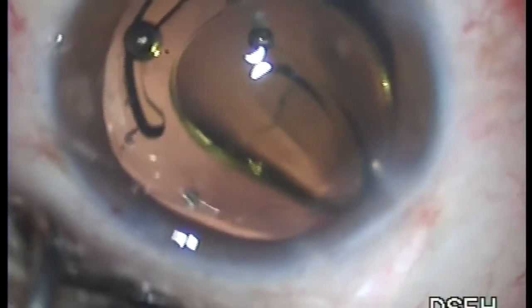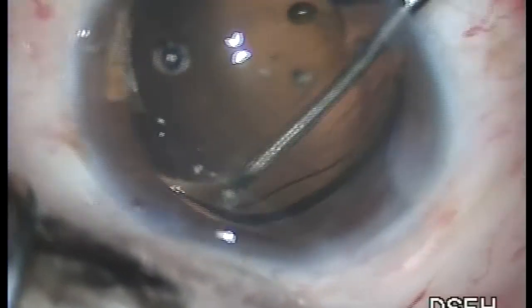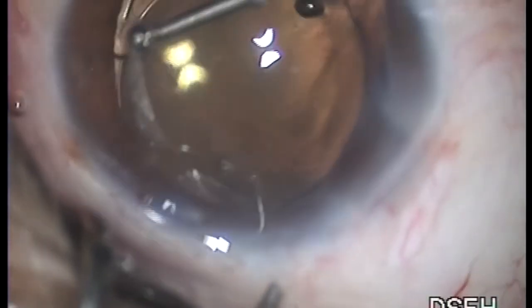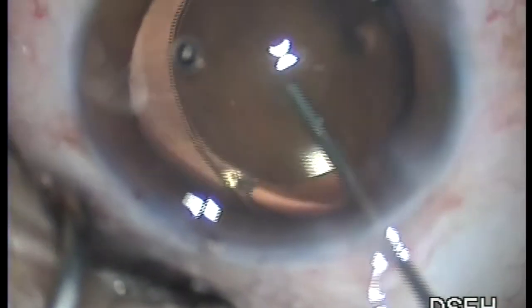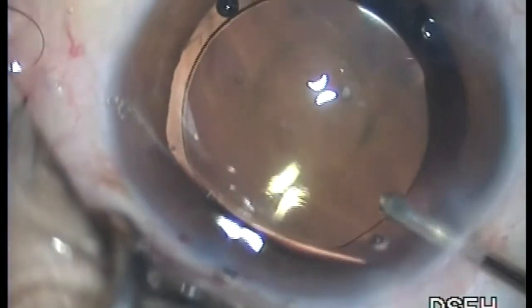All that remains is putting an implant into the bag, which is very easy because there is so much space for the optic and haptics. There is absolutely no problem in lens implantation. No vitreous was lost and no anterior vitrectomy was needed.